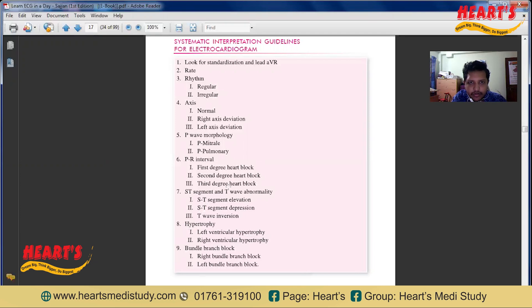In this video I will talk about the first four points: standardization, rate, rhythm, and axis. In the following videos I will try to discuss about the remaining properties.